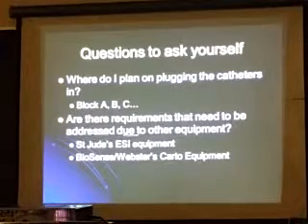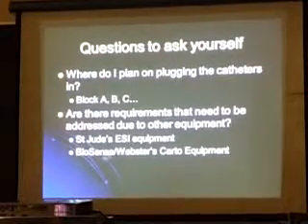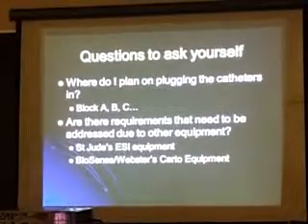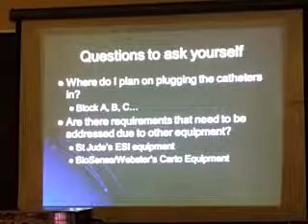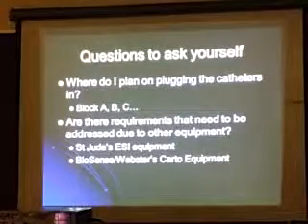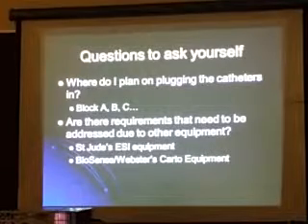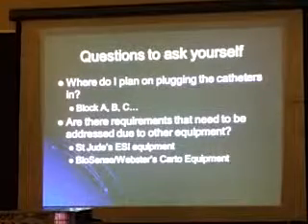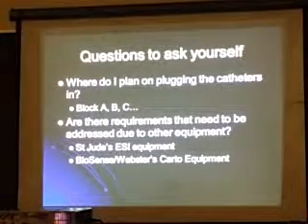Are there other requirements that need to be addressed due to other equipment? St. Jude's ESI and Biosense Webster's CARTO, because of the way they do things and how their different cabling is set up, you may not be able to program it the way you want in the most efficient way, because they're requiring you to program it a certain way so it actually goes through their system the way it's supposed to. Okay? They're all starting to talk to each other now.